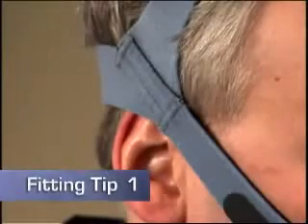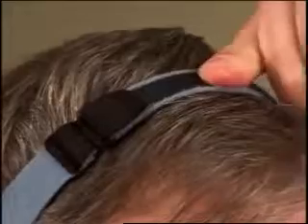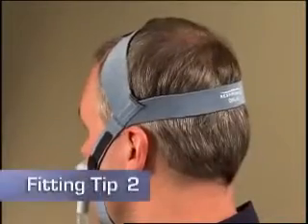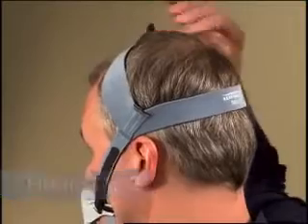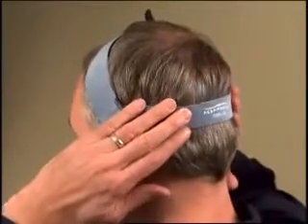If the side headgear straps rest on your ears, tighten the top headgear strap to move them up and away. If the back headgear strap is sliding up toward the top of your head, loosen the top strap and move the back strap down toward your neck.